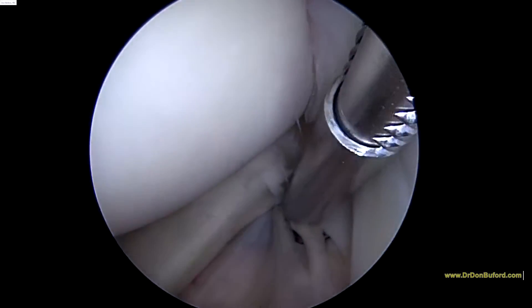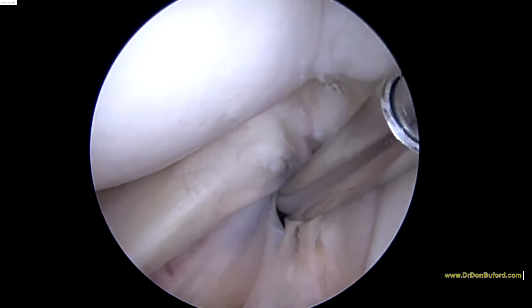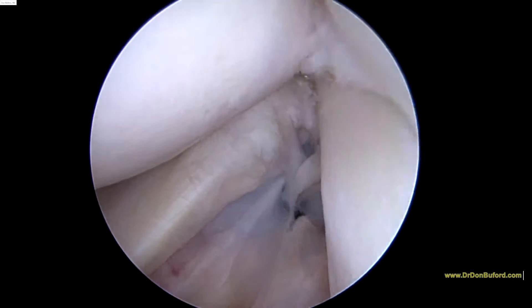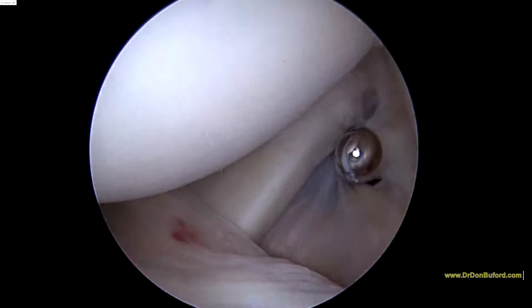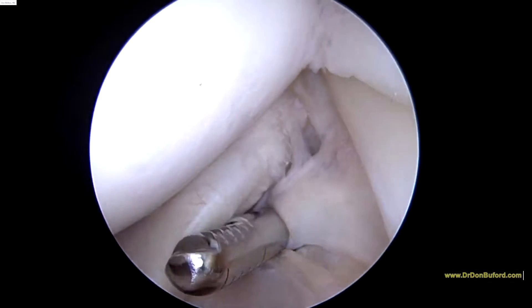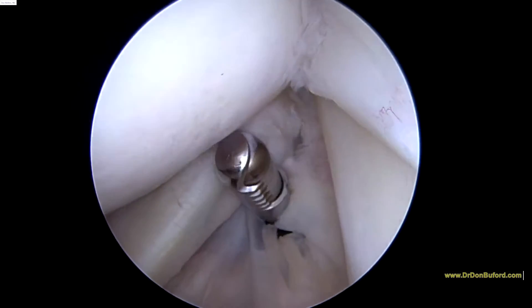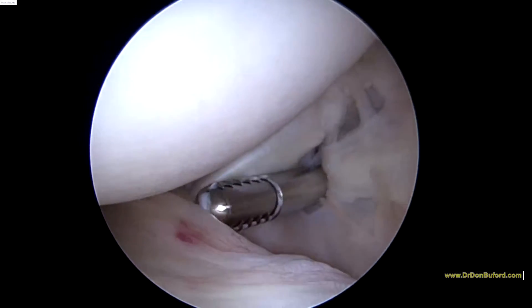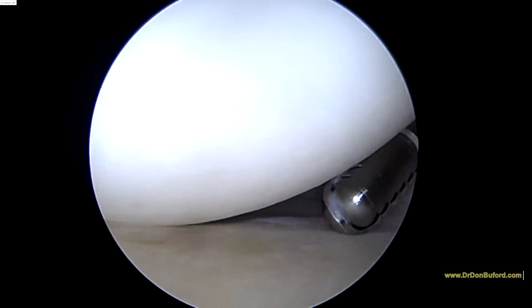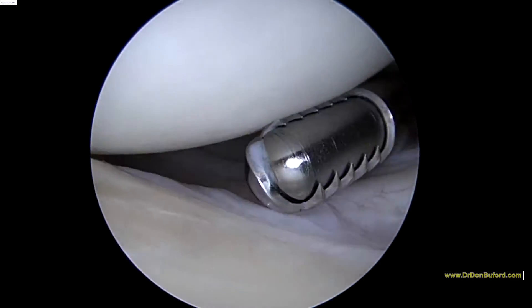We're going to look on the other side — sometimes these tears start on the bursal side. That looks pretty good. We'll look down the front of the shoulder. Here's the subscap tendon. A little bit of fraying at the superior border, but that's normal. The rest of this tendon is very solid — we were very strong in the office. As we look down the front of the shoulder, this looks good.